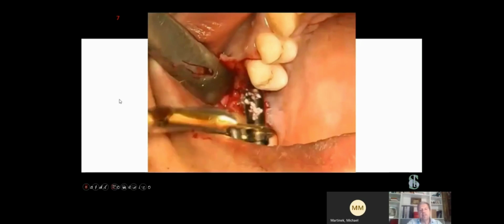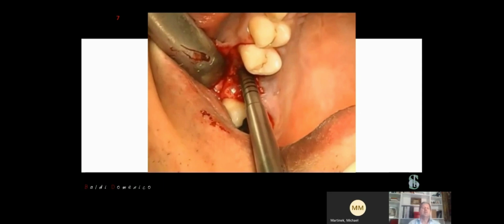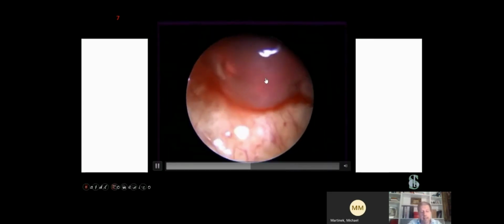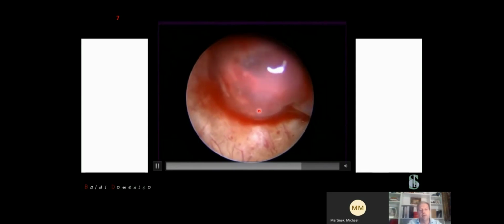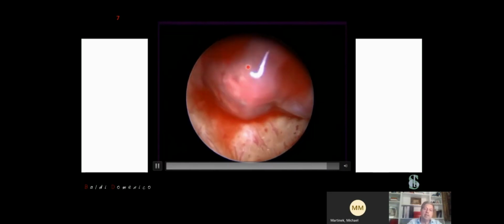Now you can understand how necessary it is to manage this situation. Look, this is the situation in which we are pushing, from this endosinus view. You can understand how important it is to manage this moment. Look here. This is the material. This is the Schneiderian membrane. See here how traumatic it could be on this Schneiderian membrane.